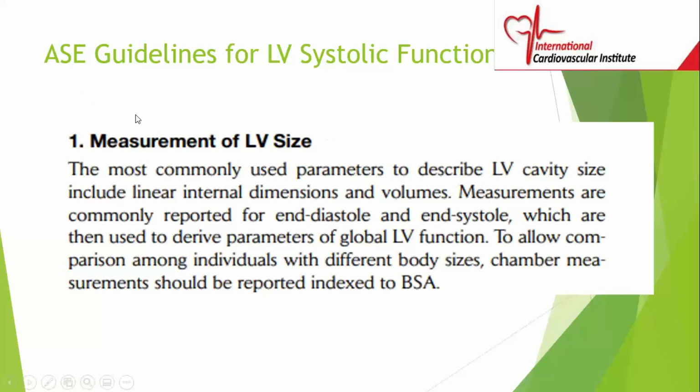Now, the measurement of LV size is something that should be routinely done. The most commonly used parameters to describe LV cavity size include linear internal dimensions and volumes.